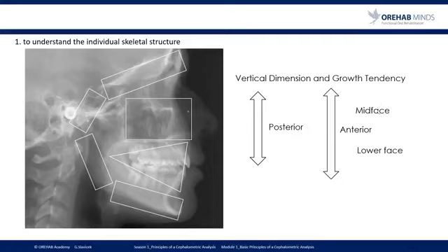Then we have the midface and the lower face. All these parameters are used to understand individual vertical dimension and the growth pattern of this skull, of this patient.